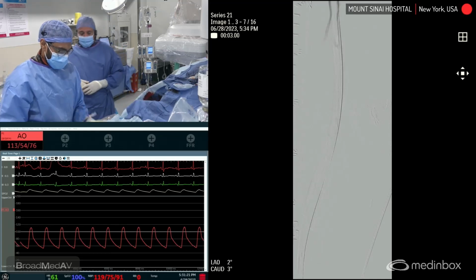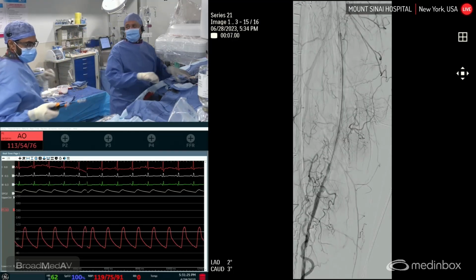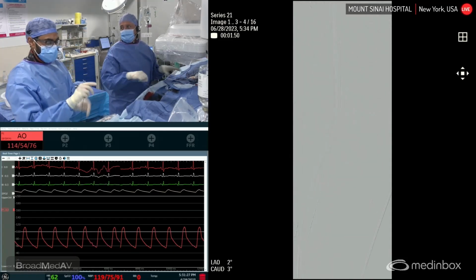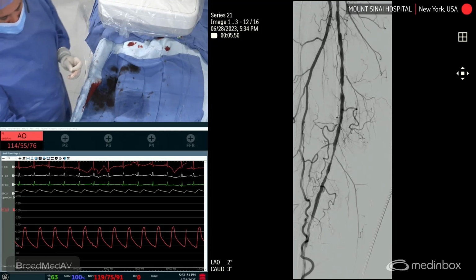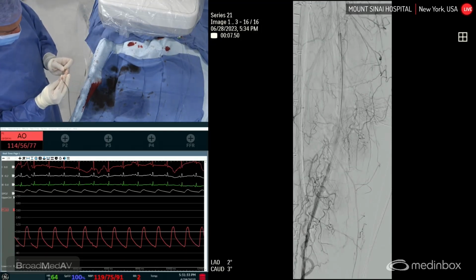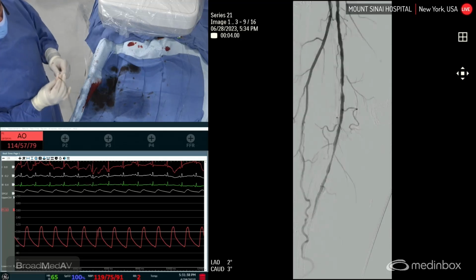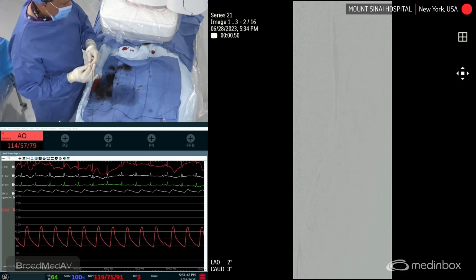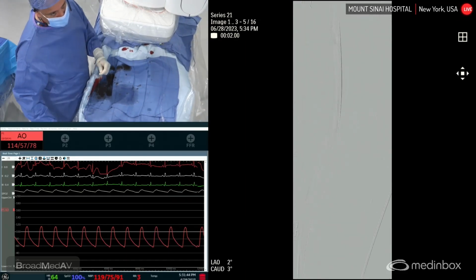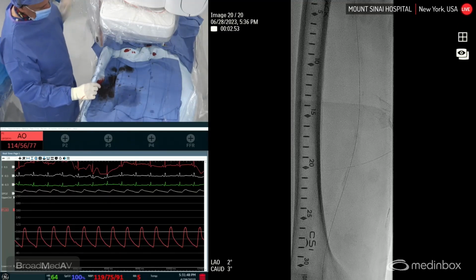So obviously we know that it's a long segment occlusion. And what was our reference vessel diameter, guys? It's a 6, so we're going with a Hawk M, which is aggressive. And I'm only going to cut the areas that are occluded. I'm really not going to go crazy here. And I know it's occluded. We'll do a little roadmap there since my glow tape is off the body here. So I'm just going to center it. Let's do a quick roadmap. Okay, ready?